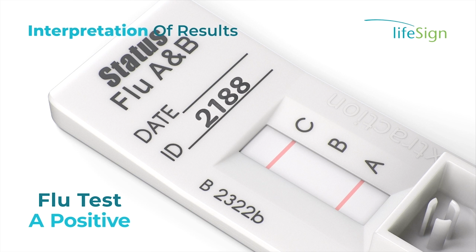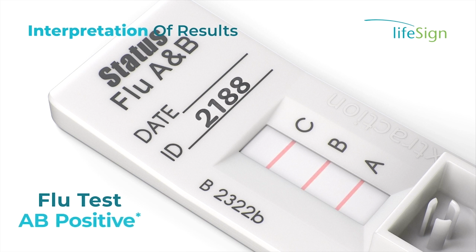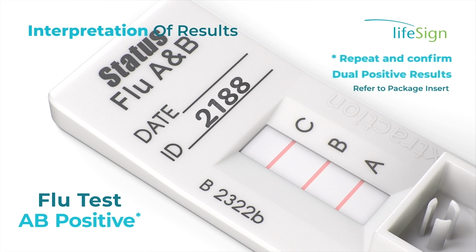A positive test is indicated by a reddish-purple line in the control position of the test device and a reddish-purple line at the A and/or B position of the device. Co-infection with influenza A and B is rare and should be retested. Repeatable dual positive results should be confirmed by PCR before reporting results.